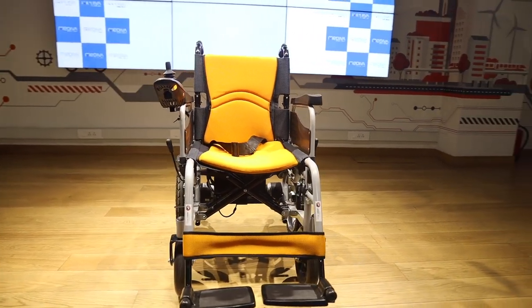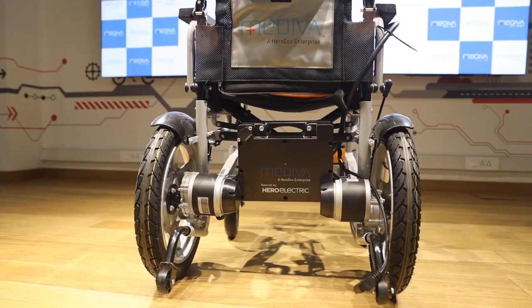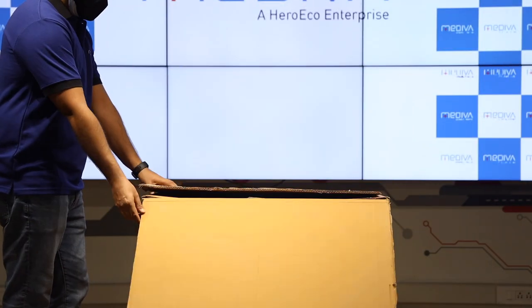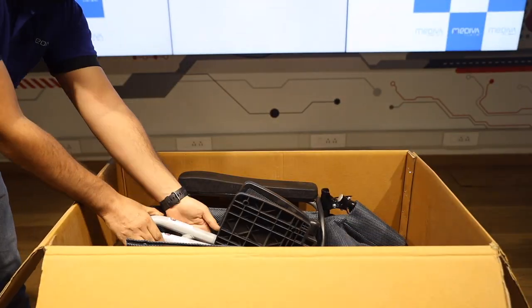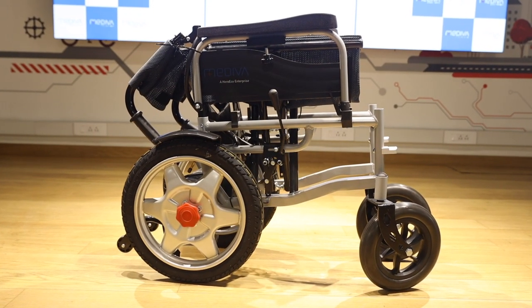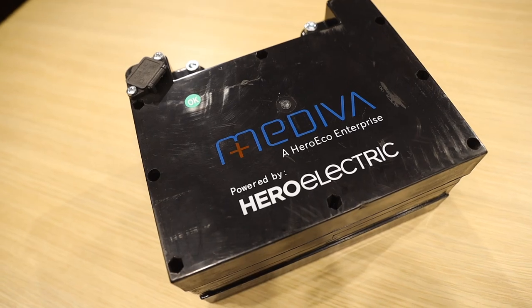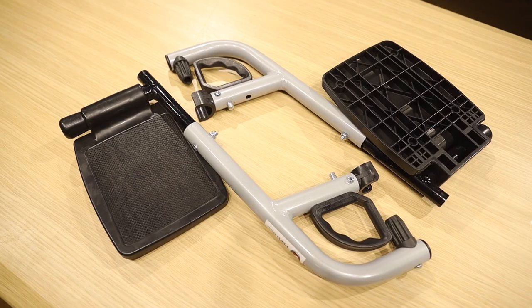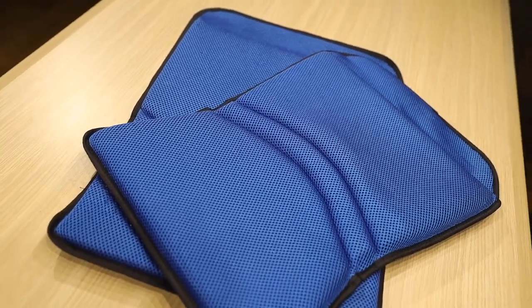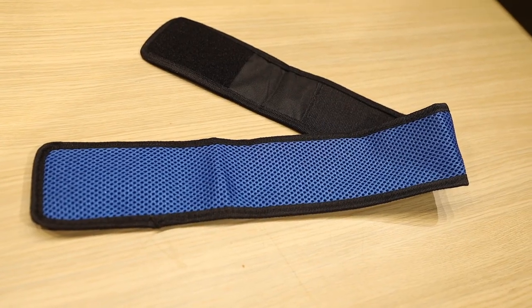Discover a new freedom with the Mediva electric wheelchair, designed to go anywhere with you. The Mediva wheelchair is a lightweight, easy to assemble, foldable power wheelchair. This wheelchair comes with a battery, battery charger, footrest, backrest, seat, and calf strap made from the finest fabric.